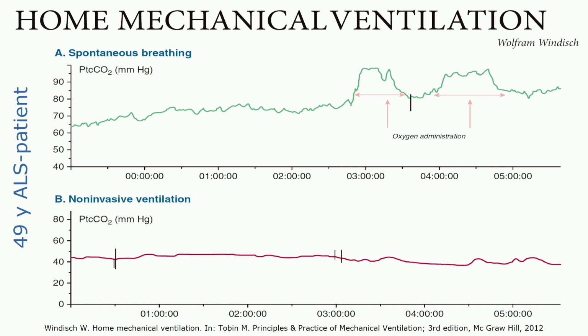And what they did was apply oxygen. This is really funny, actually. If you can see what is going to happen here, there was a sudden and huge increase in the pCO2 value as transcutaneously measured. So they also realized that something was wrong.